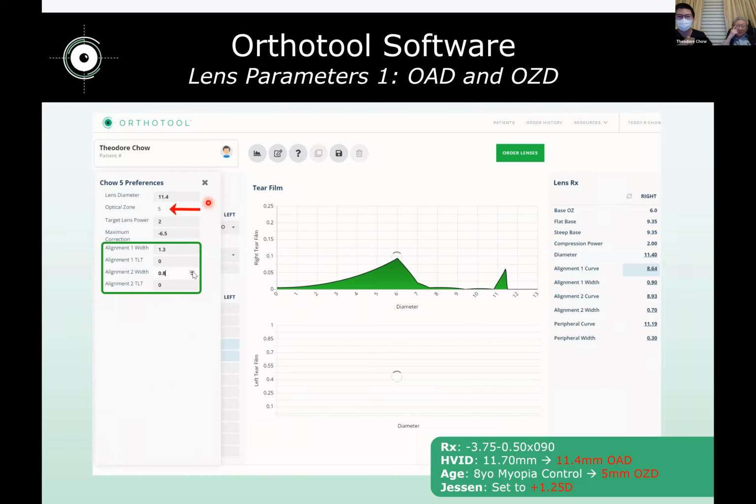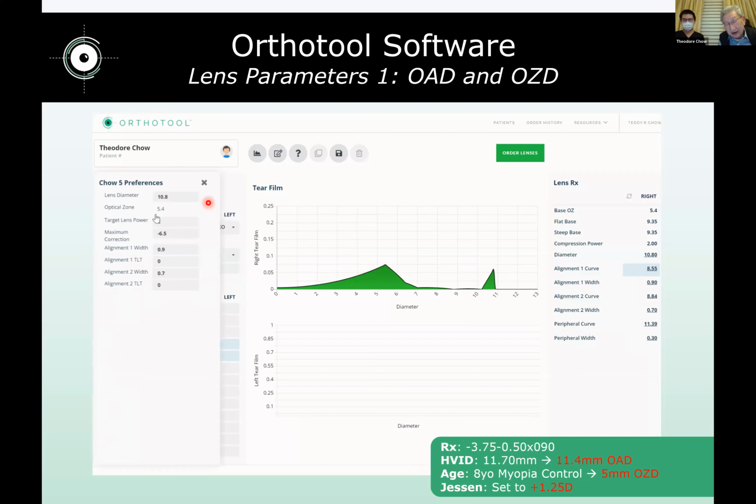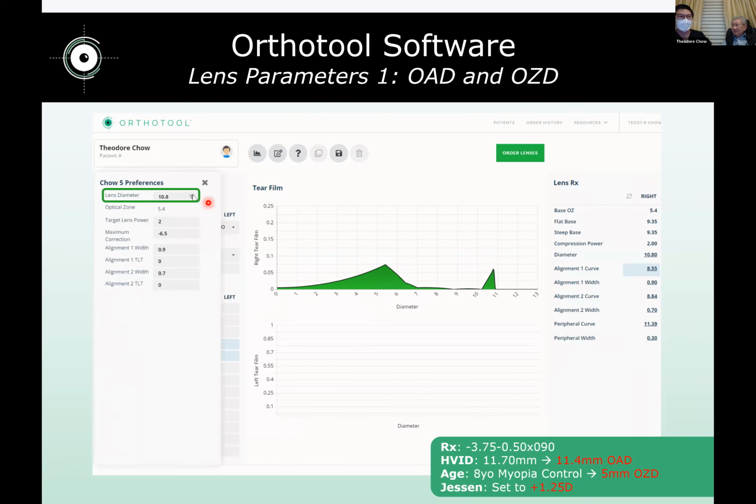I have no idea. According to my research with Pat Caroline, the best optical zone on average is 5.2 to 5.4, mostly used. Certainly, I tend to overthink things, and I remember when I was talking to Randy Kojima, I was very confused about what's ideal. He gave some really good advice: it doesn't really matter as long as it's a small optic zone, and you can adjust accordingly. But I do like 5.0, 5.2, maybe there's an ideal 5.2 to 5.4, but certainly a smaller optic zone.